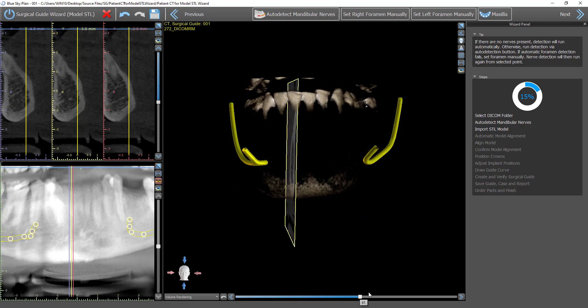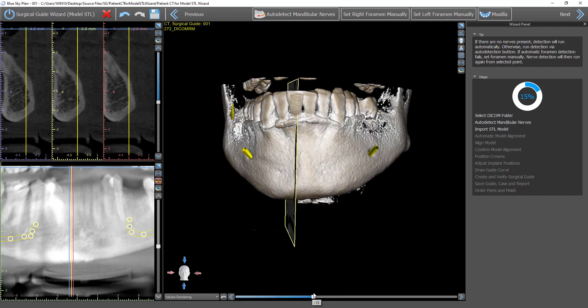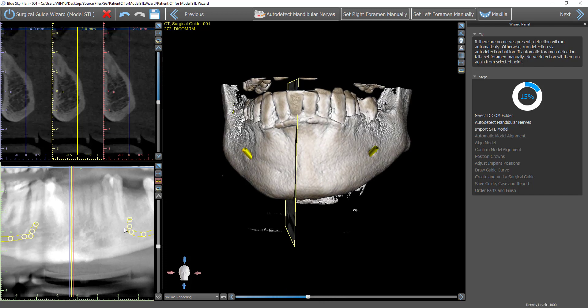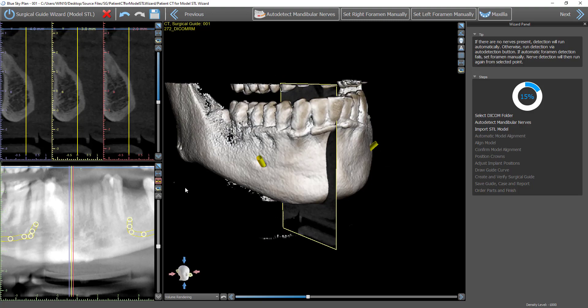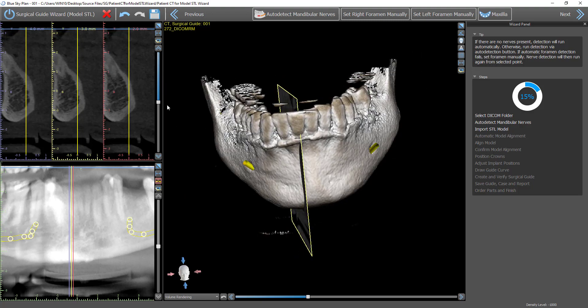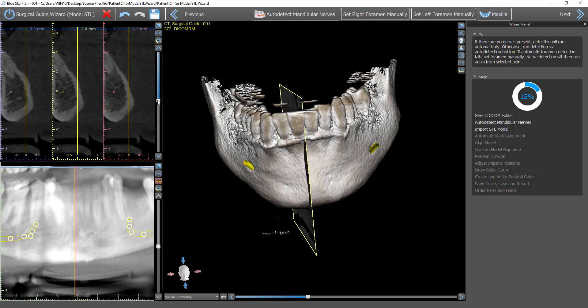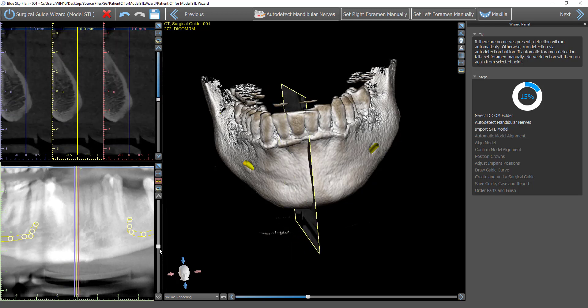And here we see that the nerves have been detected 100% automatically. There's no user intervention, no need to click on the entrance to exit any points. We have that done automatically. The nerves are detected by the software.